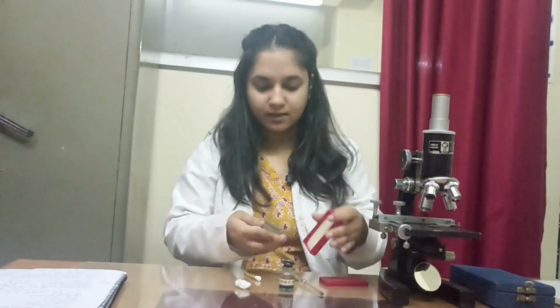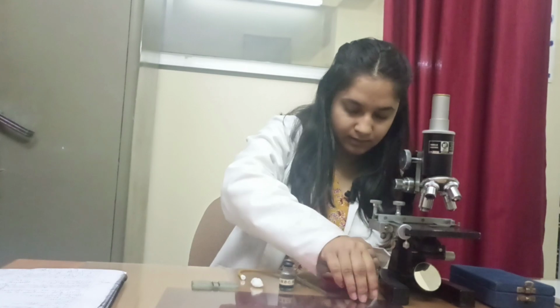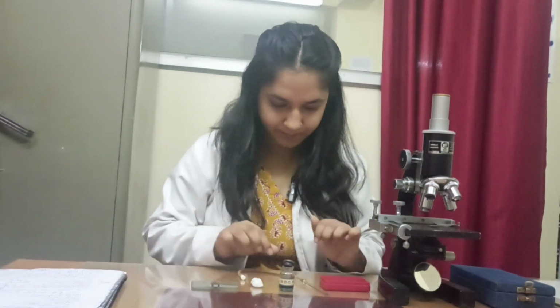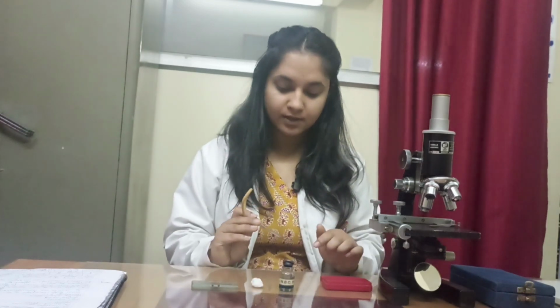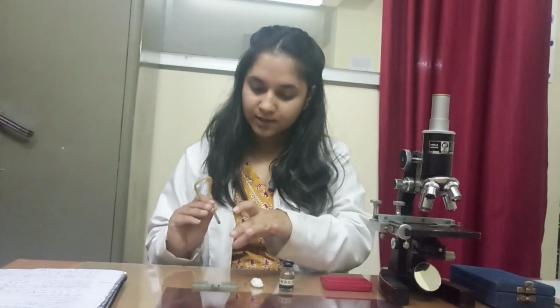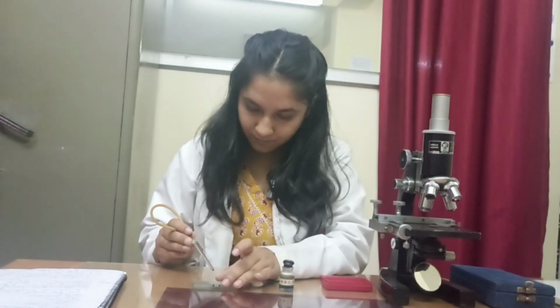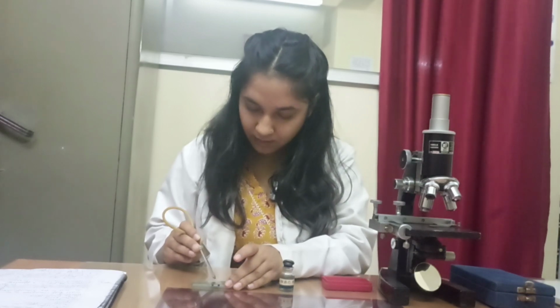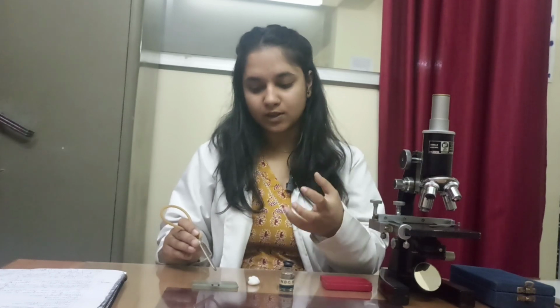After that, we take this Neubauer chamber and put this cover slip on the Neubauer's chamber. After discarding 1 or 2 drops of solution, we should put this pipette on the Neubauer's chamber to charge this chamber. For charging the chamber, we should know the steps.